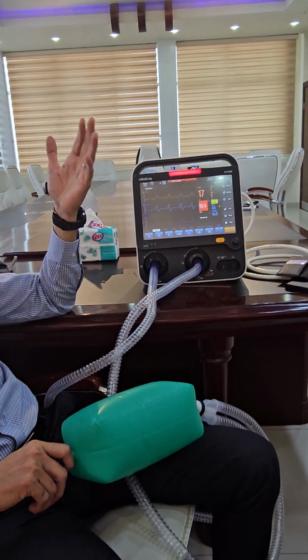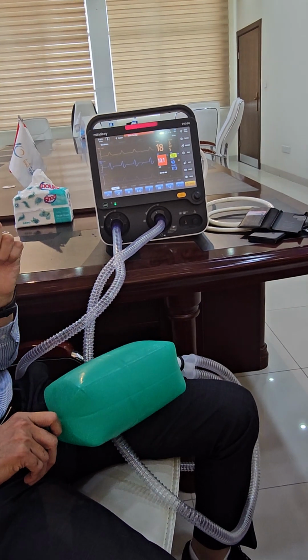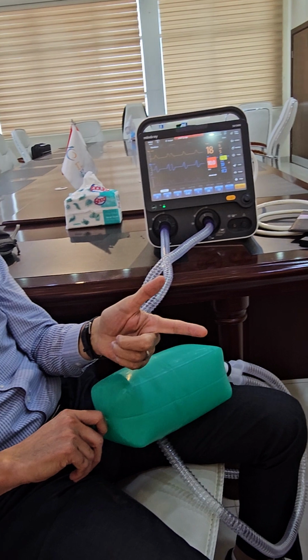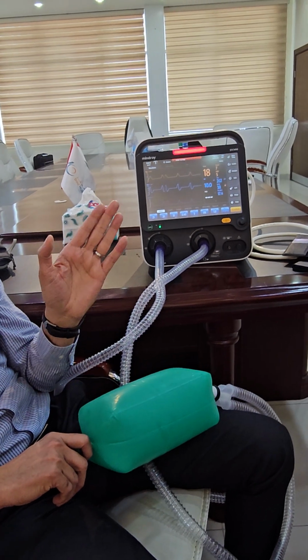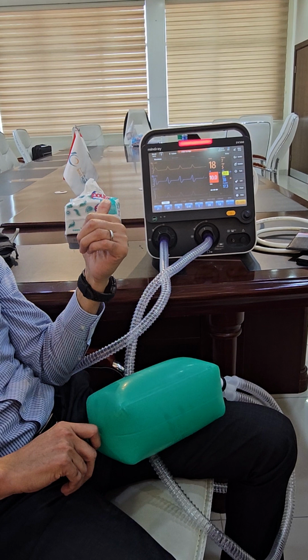Here you have many parameters, but you can only select 2 because the time is fixed. If you select rate and inspiratory time, the expiratory time will be by default. If you select the time and IE ratio, the rate will be by default.